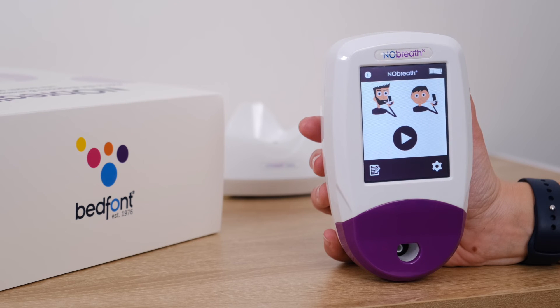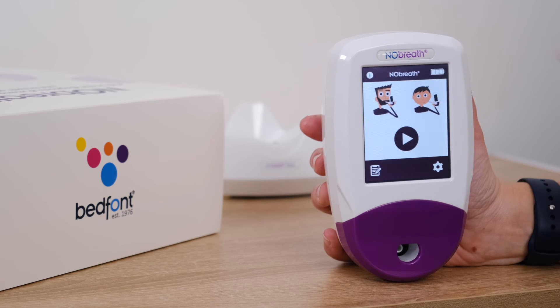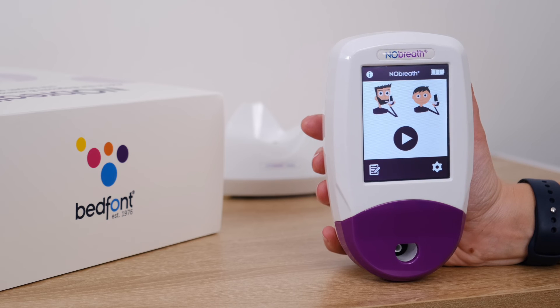The battery status can be found in the top right hand corner. It is best practice not to let the battery run flat, and thanks to the No-Breath dock, you can keep the No-Breath charging when it's not in use. The device can perform up to 100 tests on a full charge, and it's recommended to begin charging the No-Breath once the battery status drops to one bar.